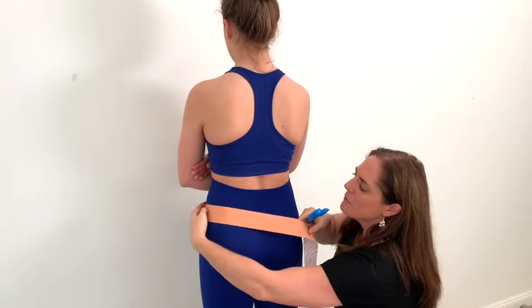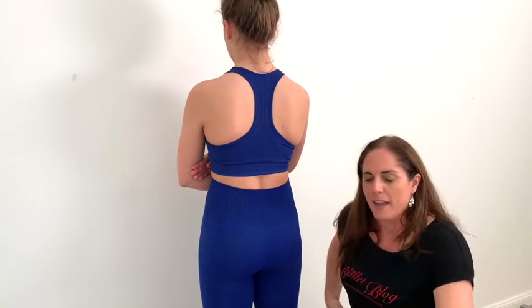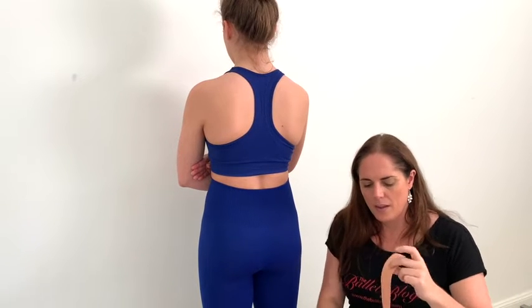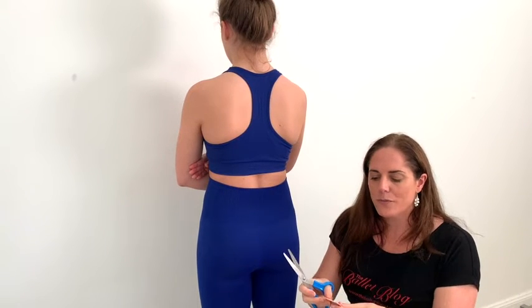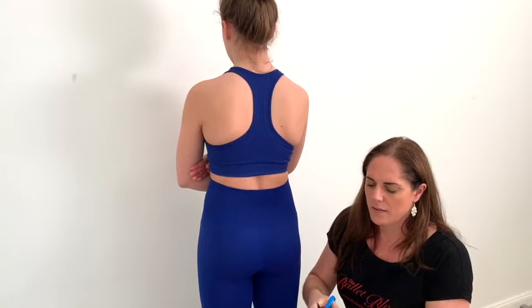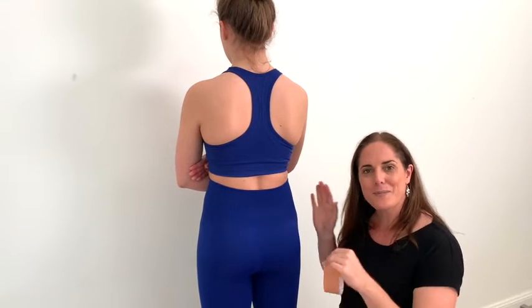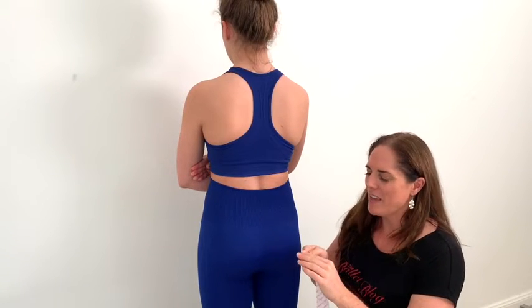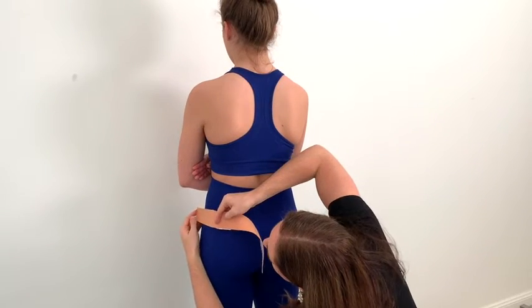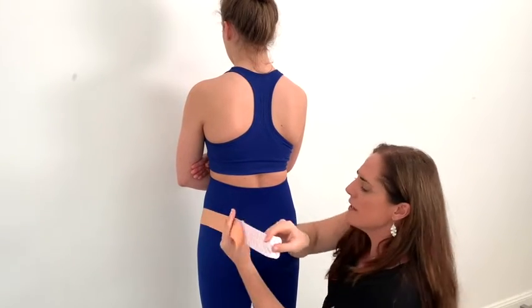The first one is a simple strip right around the back of the pelvis, with a little bit of stretch on there. I always round off those ends, and for the demonstration we're doing it over the top of the pants but you'll obviously do it on your own skin. Peel off about 10 centimeters, coming around from right around the side of the hip — don't start too far around the back, right on the side.